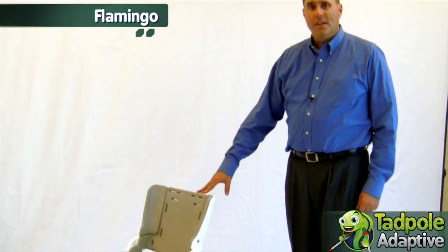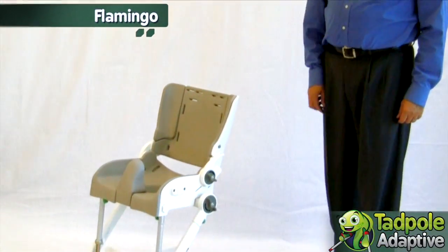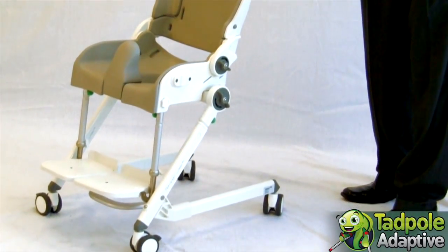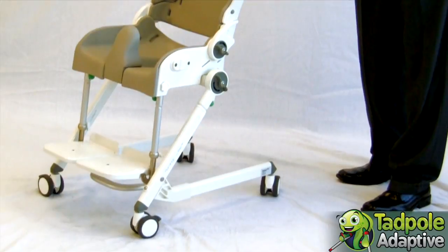Hi, I'm Derek with Snugseat. Today we're going to look at the Flamingo. The Flamingo is a rolling shower commode chair available in four sizes, and this is a size three.